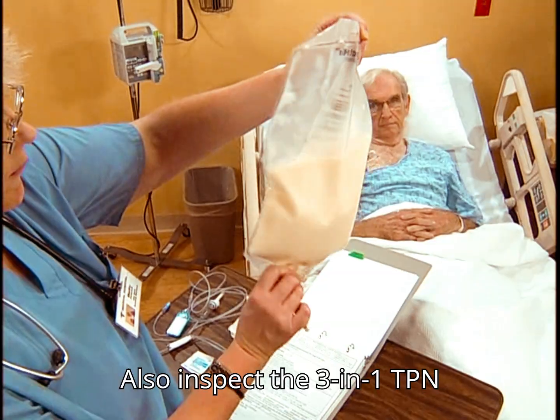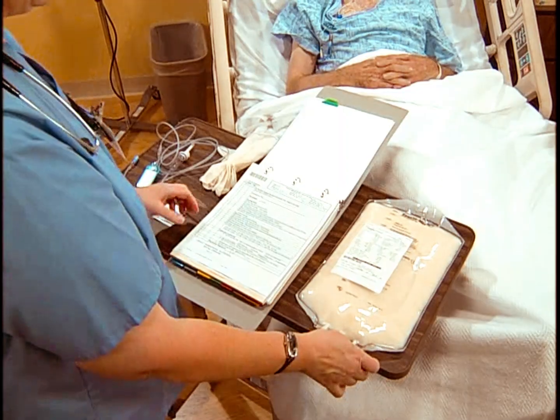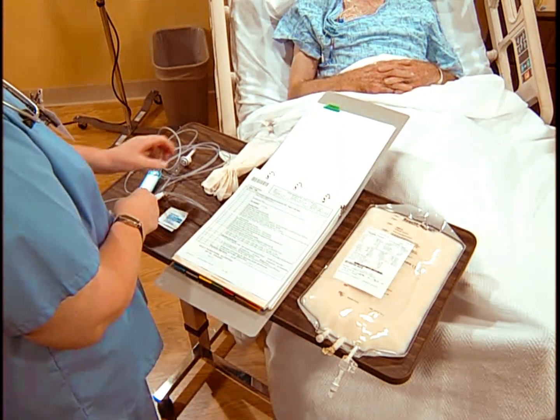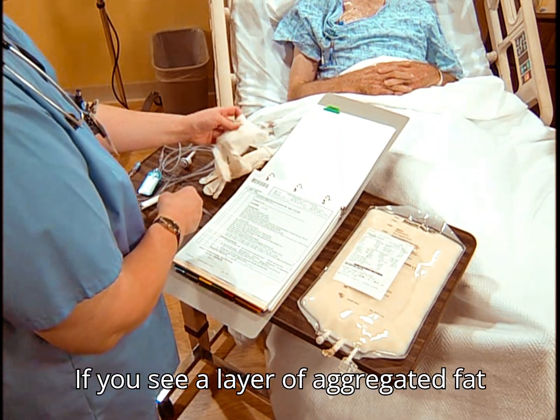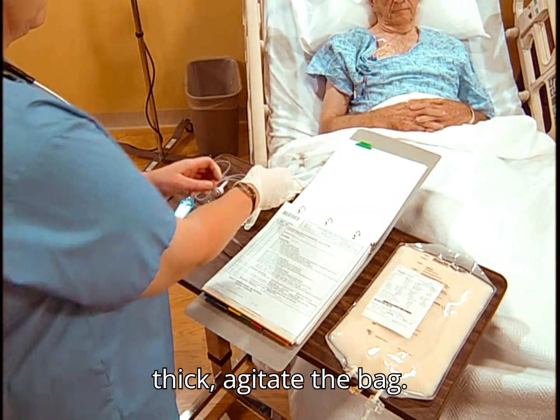Also inspect the 3-in-1 TPN solution for a cream layer or fat separation. If you see a layer of aggregated fat droplets about 1 to 2 centimeters thick, agitate the bag.